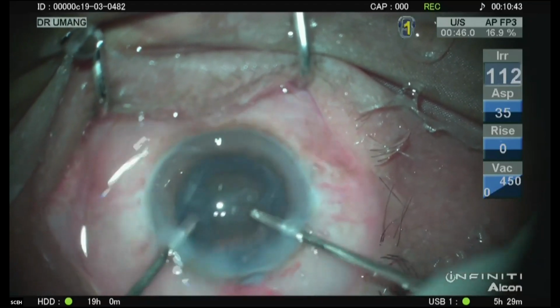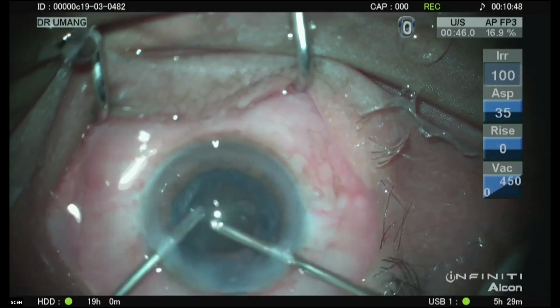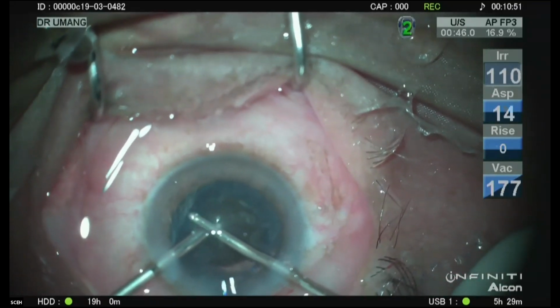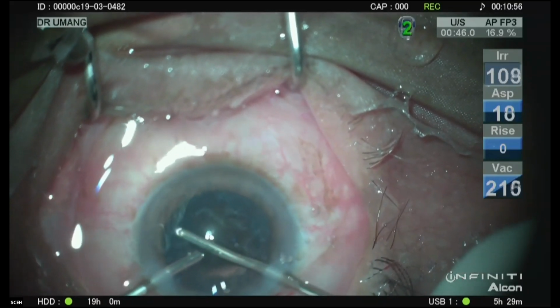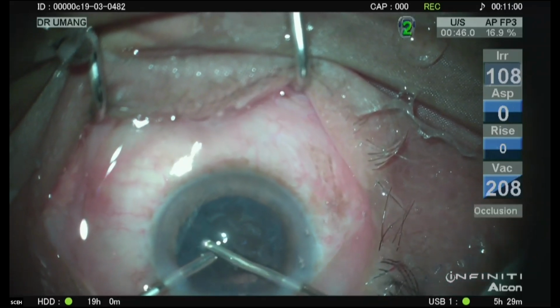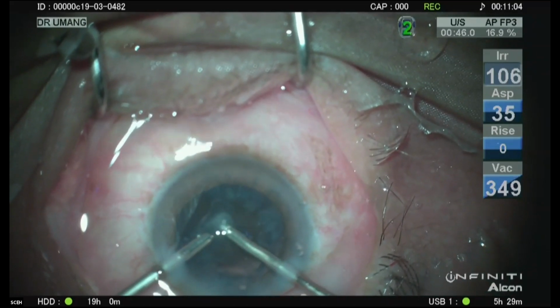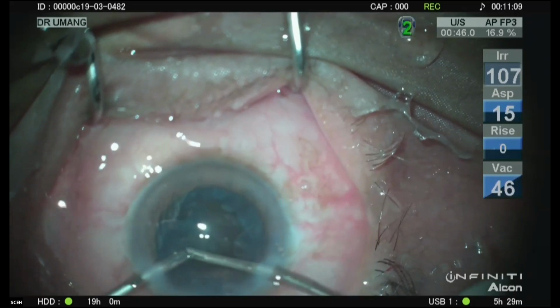And it shouldn't tilt too much towards the posterior capsule. So I go inside the capsule, and I'm not pressing the foot pedal completely. And I'm trying to bunch up the cortex. When I feel there's sufficient cortex in it, by pressing the foot pedal, I come out, and I'm outside the bag, and here it's safe to press my foot pedal completely.